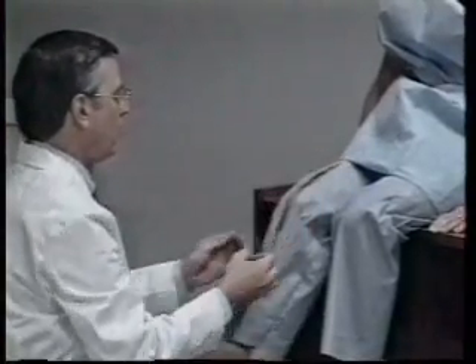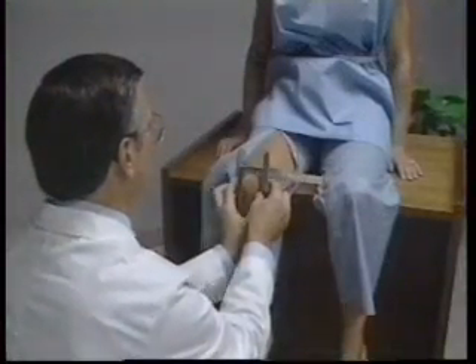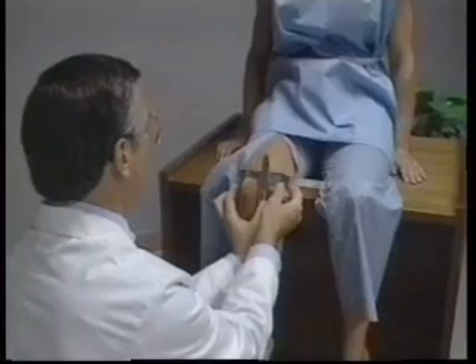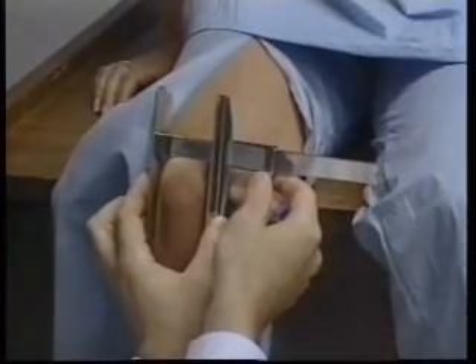For upper leg length, the subject sits on the measuring table. The lower part of the right leg hangs freely over the edge of the table and the right knee is positioned at a 90 degree angle. The small sliding caliper is positioned firmly against the distal end of the femur on both sides of the patella, as if one were to measure the breadth of the patella. The horizontal bar of the caliper should be touching the anterior surface of the thigh.